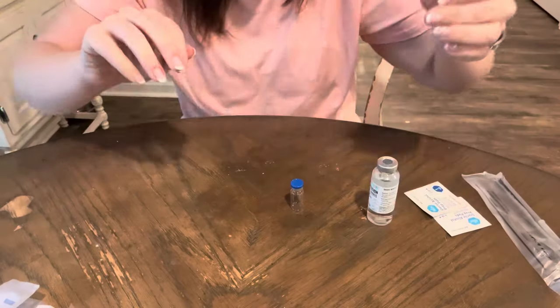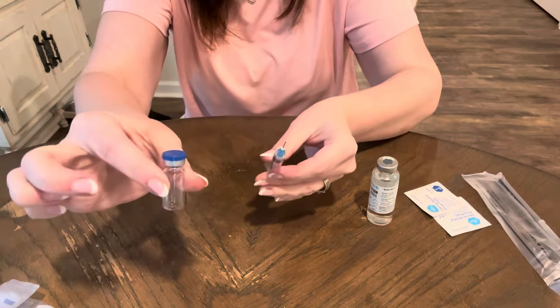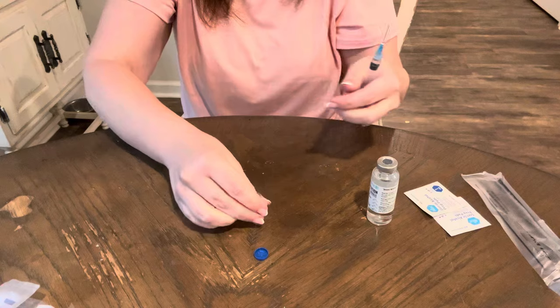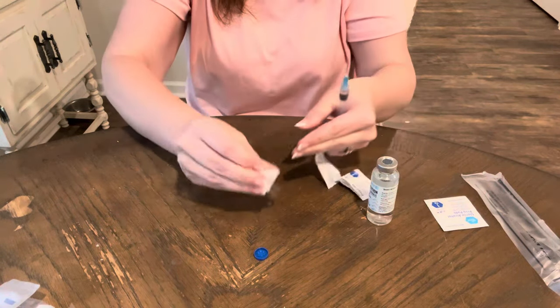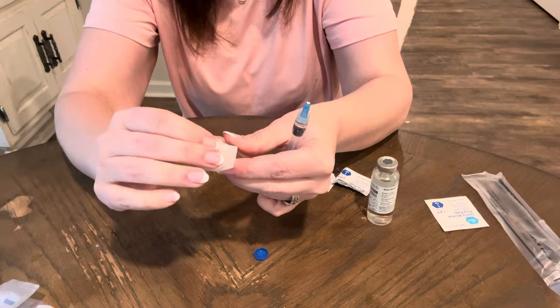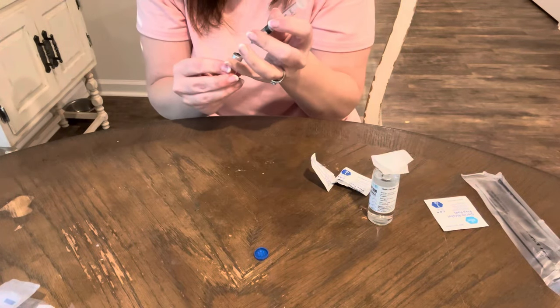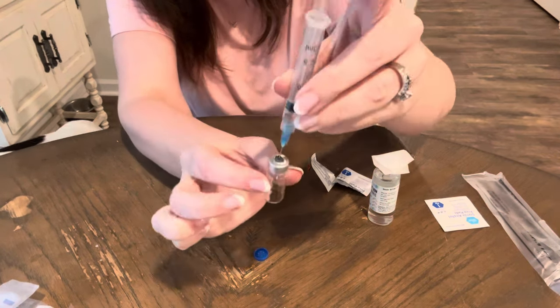There — you can see there is exactly half a milliliter in there, which is what you want. Next, take your little sterile vial and pop the lid off. Go ahead and sterilize the top of it with an alcohol pad — it's allegedly sterile to begin with, but it can't hurt. Then insert the needle into the top of the vial and shoot the medicine down in there. You can see the Manjaro is now in the bottom of the vial.